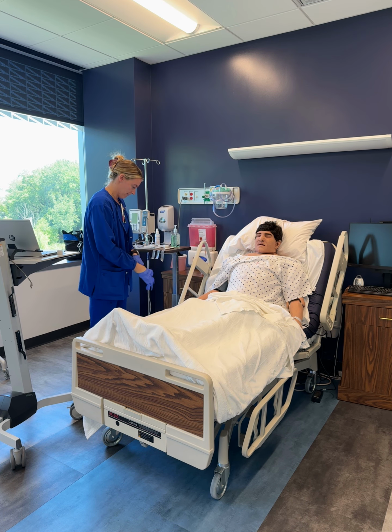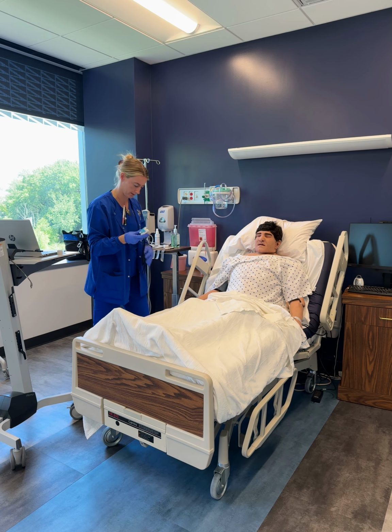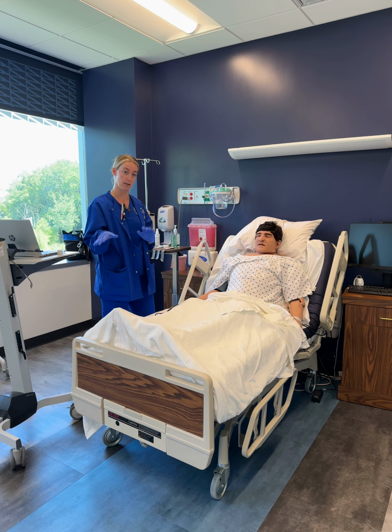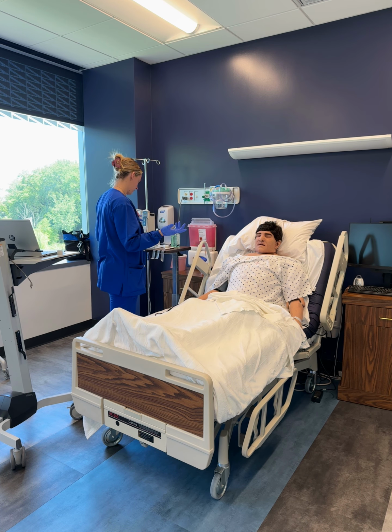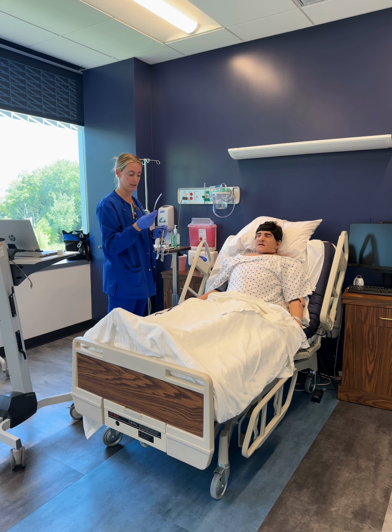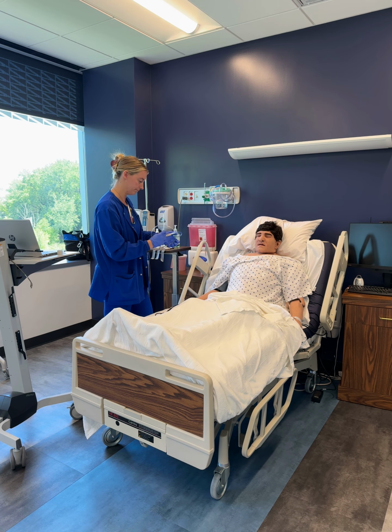Before starting the process, we're going to put a pulse ox on to measure the patient's O2 sats during this time to make sure that they do not drop. I am then going to lubricate the tip of the NG tube for at least 4 inches, and then we will start the process.